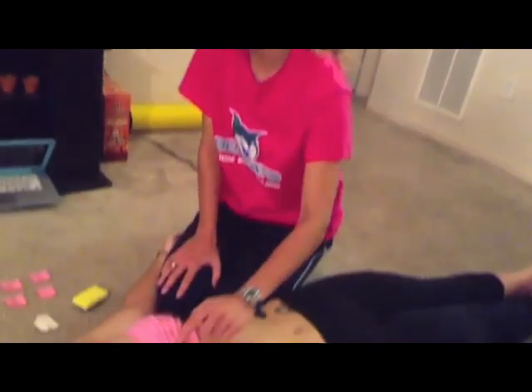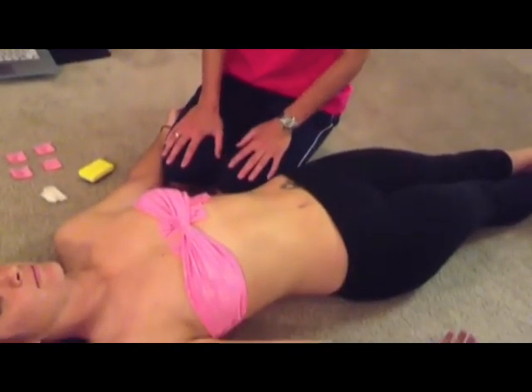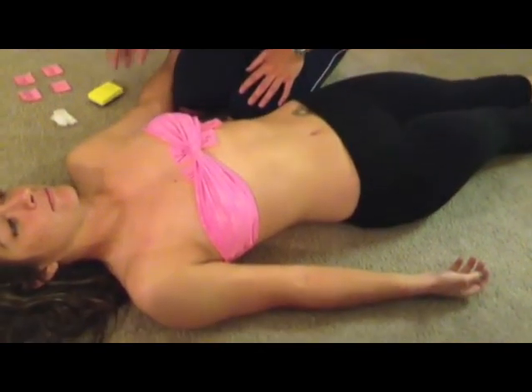For an exercise EKG, instead of having electrodes on the wrists and ankles, we move them onto the torso. However, just like the resting EKG, the 6 chest leads remain in the same spots. We begin with the limb leads, moving them onto the torso.